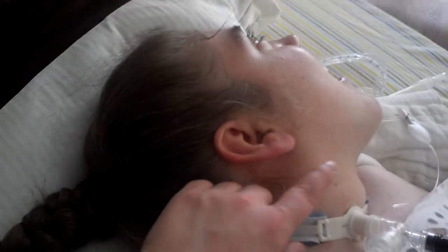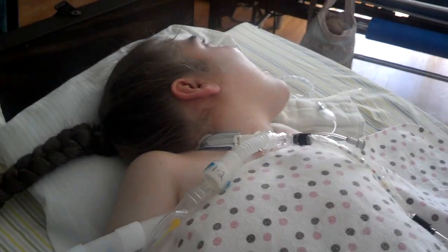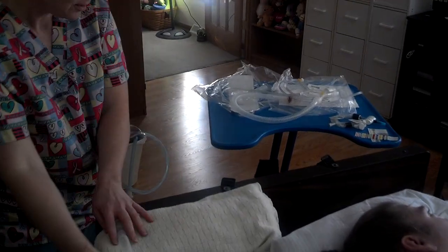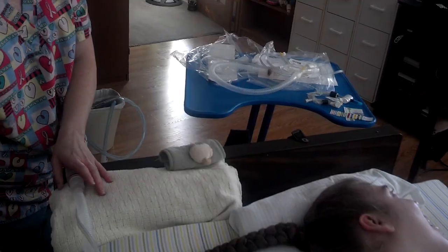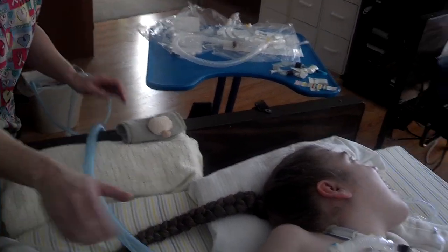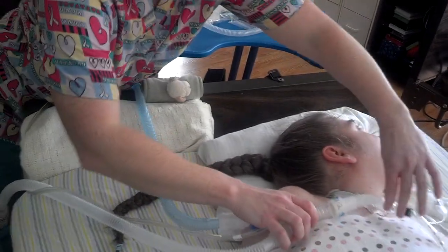Amy's already done all of her trach care, so she's good and cleaned out so we don't have to deal with any of that while we're doing the circuit change. It's just hard to change your focus — it's nice to do one thing at a time. So she's got her new blue tubing.